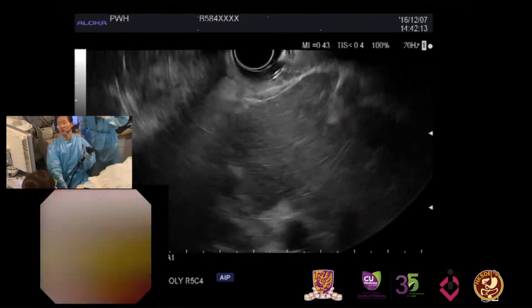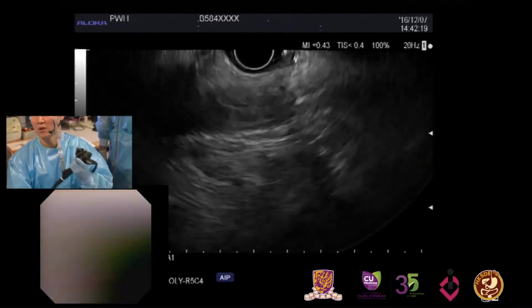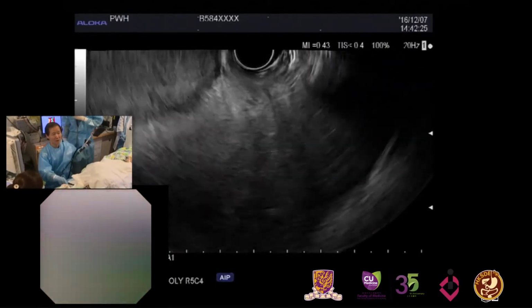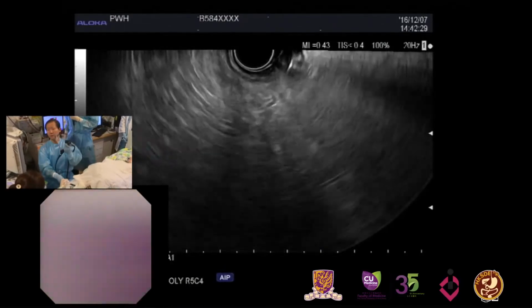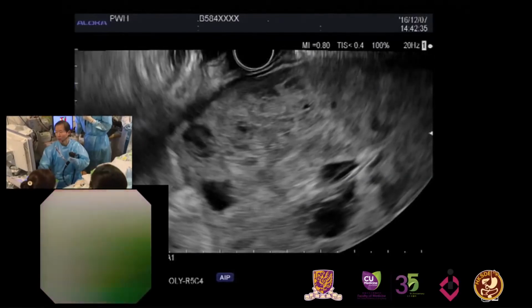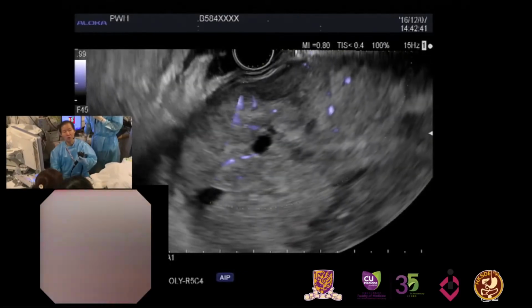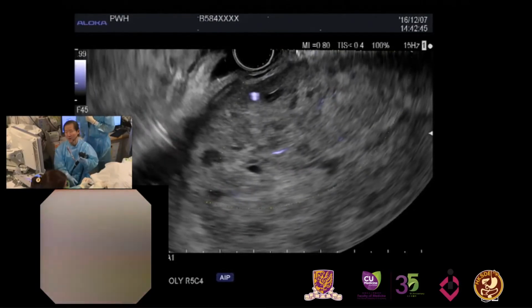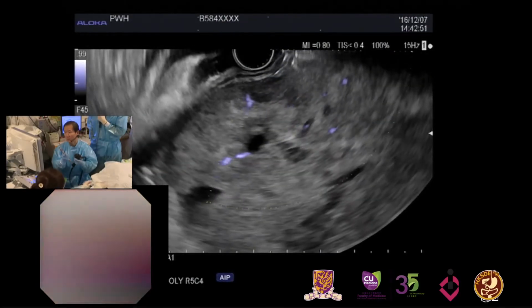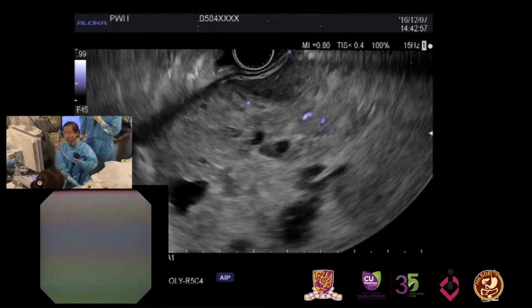Maybe better to target the area where there was sort of... and also the vascularity is one more issue. The angle and position is not stable, and the vascularity too. So you target the extragastric part? Yes, the extragastric part. This part is quite stable, and before needle puncture, we will check the vascular and non-vascular areas. The E-flow function is quite useful to check because E-flow can depict some of the microvessels. So I think this area can be a good target.